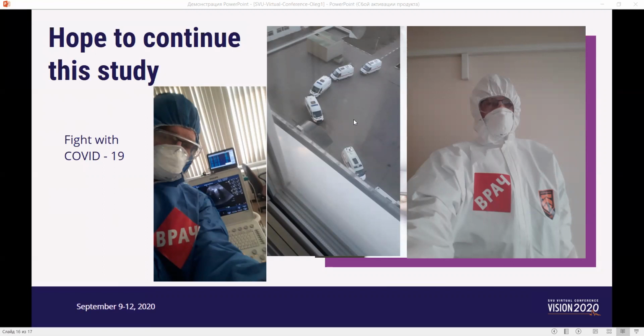In summary, our findings offer early indication that wall shear stress values on the surface of carotid plaques can lead to early detection of carotid plaque vulnerabilities. We think this is very promising, and we do have plans to continue the study in the future.